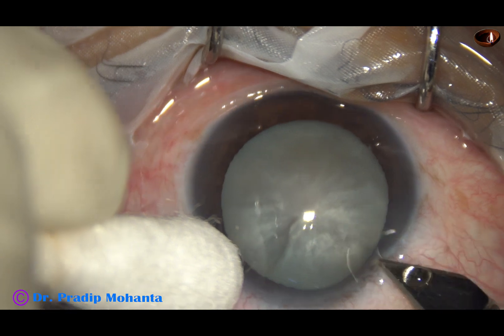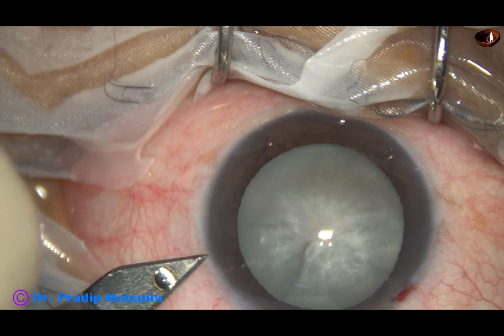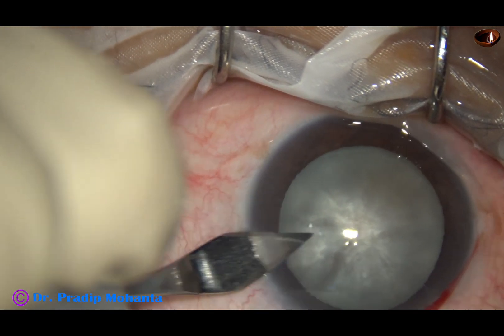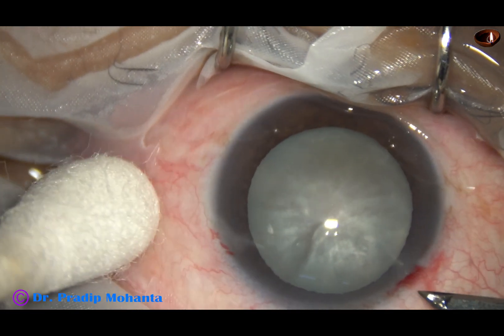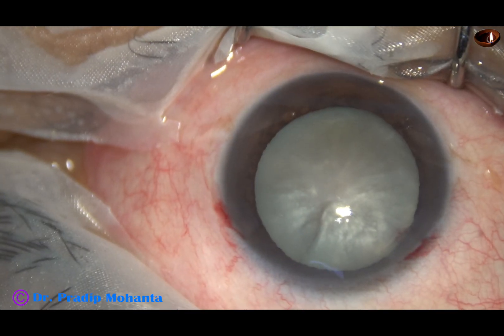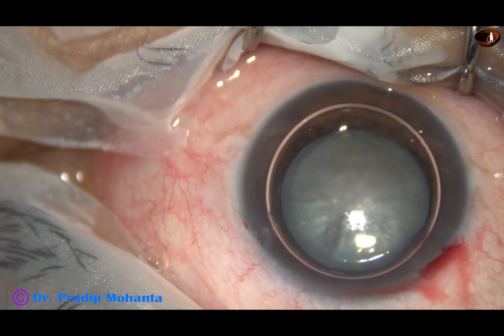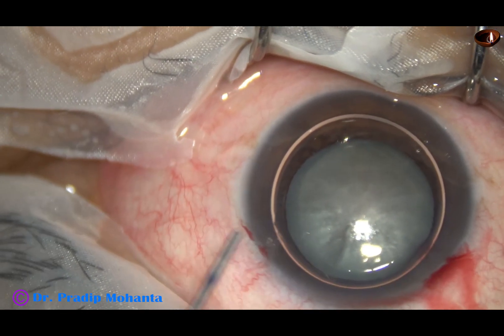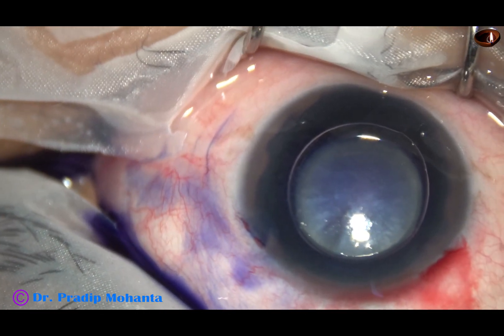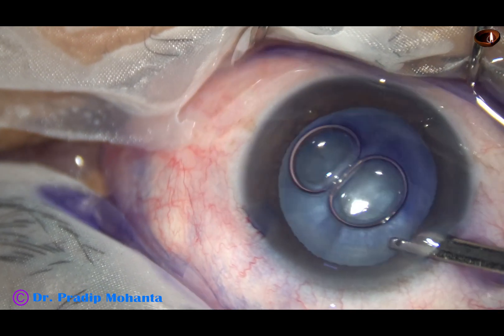This is an intumescent cataract. In intumescent cataracts, the most important step is capsulorexis, because there is very high incidence of rexis run out in intumescent cataracts. So in such cases, the best way to do rexis is to do a small rexis first, then aspirate some lens matter, decrease the intralenticular pressure, and after that we can easily enlarge the small rexis into an optimum-sized rexis.